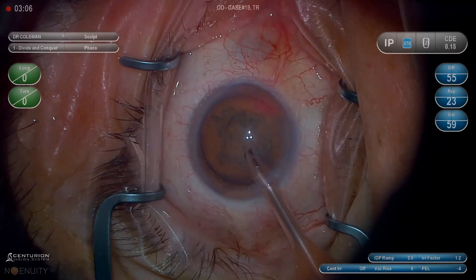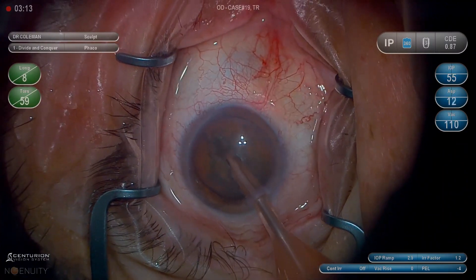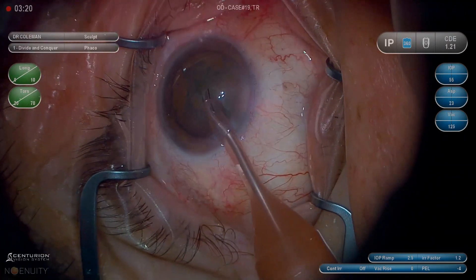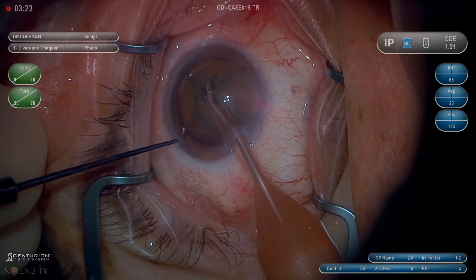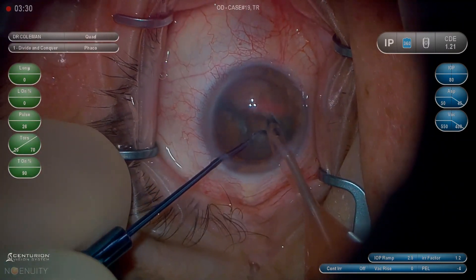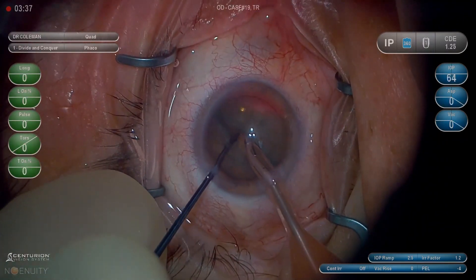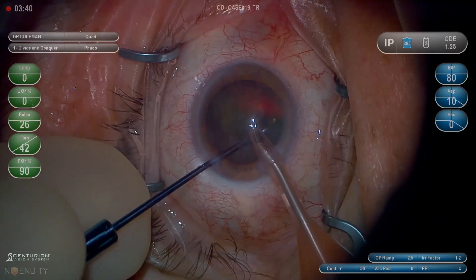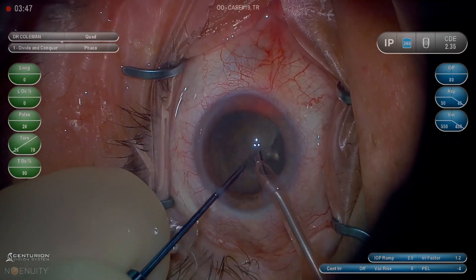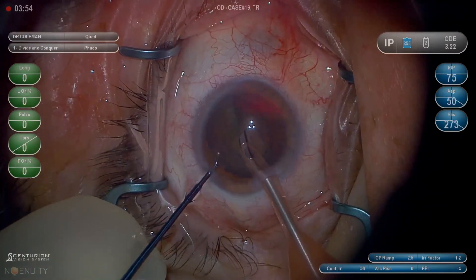Once we've sculpted three grooves, we want to be really careful — light on the foot. Make sure we don't go too deep or too equatorial, too far from the center, because that's when you get unpredictable things happening. It's also very important when you begin sculpting to make sure you're actually in sculpt mode. A lot of times the pedal gets accidentally touched, it clicks to quad and you won't notice until you're in the eye and things are erratic. The Ingenuity display is really nice because it's a heads-up right in front of you — almost like an instrument panel in an airplane — so you can see you're in quad without having to turn and look at the machine.